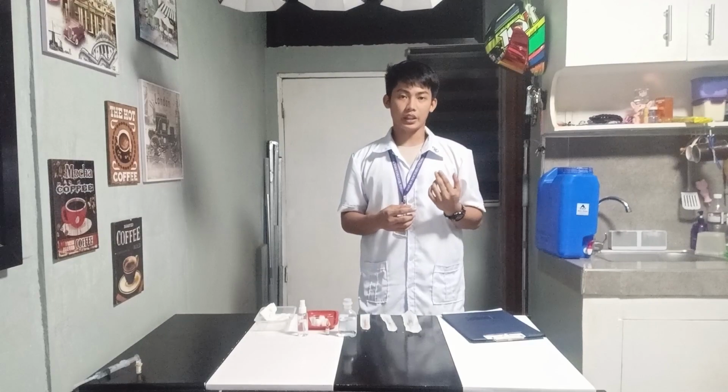Now, in preparing the medication administration, it is important to follow the three checks for administering medication. Read the label on the medication: first, when it's taken from the medication cart; second, before withdrawing the medication; and third, after withdrawing the medication.